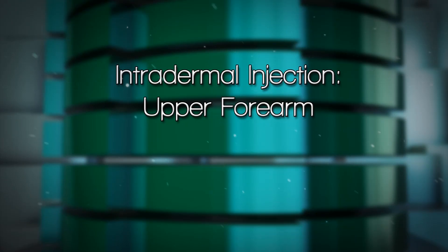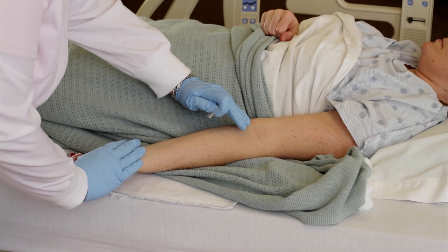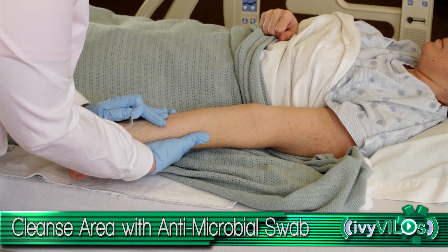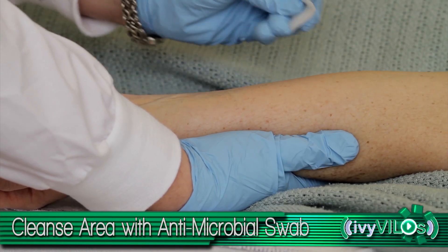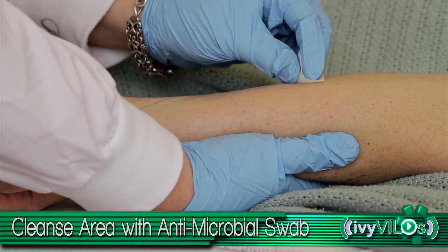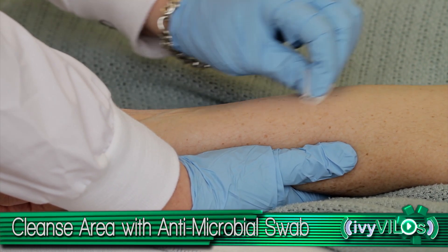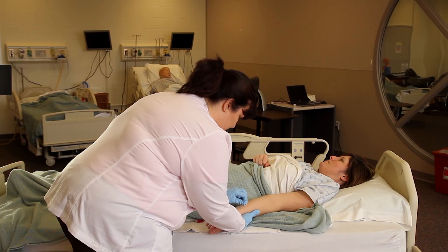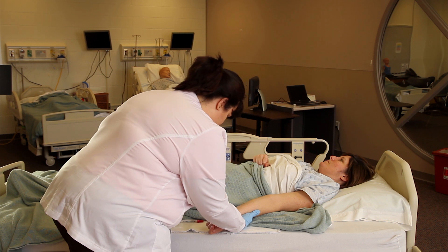Intradermal injection. Cleanse the area with an antimicrobial swab. Use a firm, circular action moving outward from the center. Let the area dry.